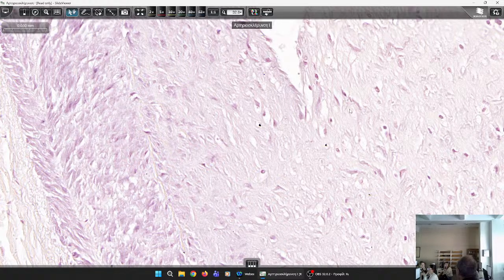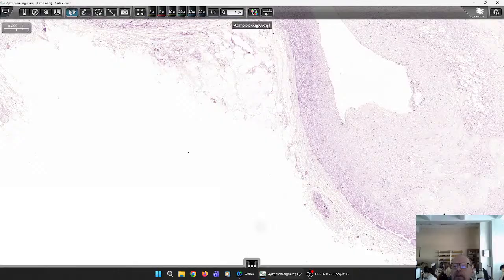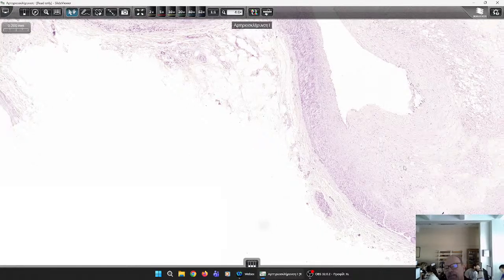So you can watch the video and learn what to define in the histologic slides. So what do you have to define for this particular slide? We have the cholesterol deposition, the macrophage, the fibrous tissue, and the vulnerable point, which is where the normal size of the inner layer goes to the area where it is thickened. That's all.